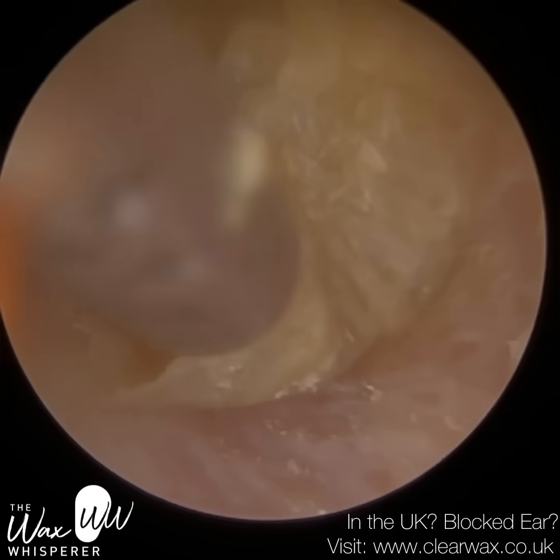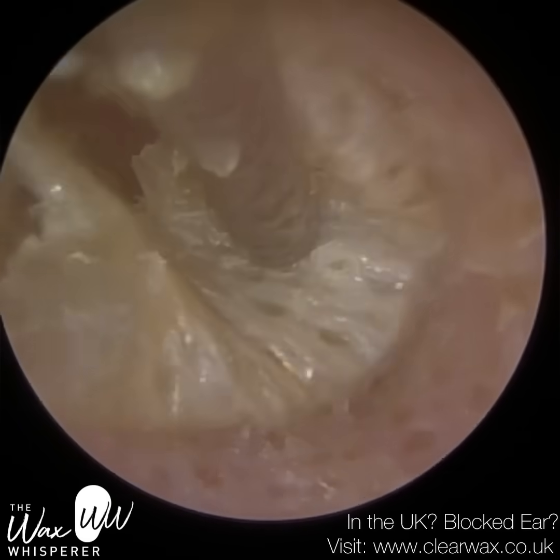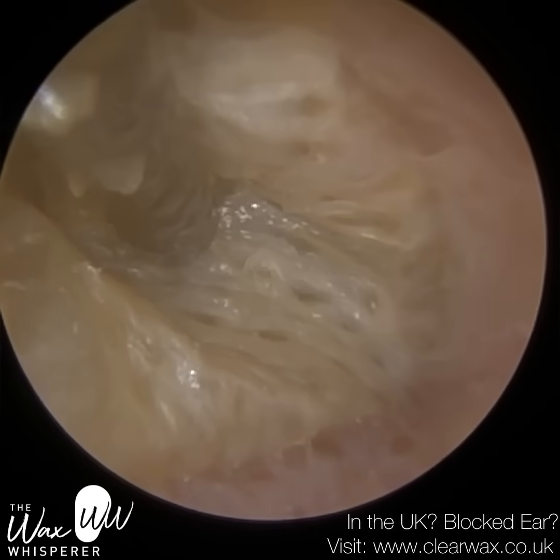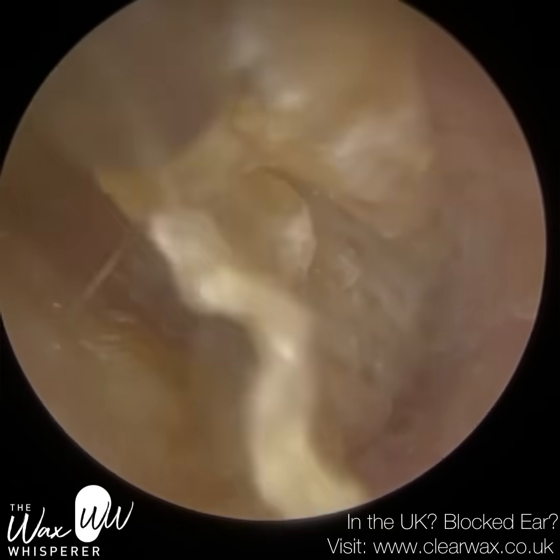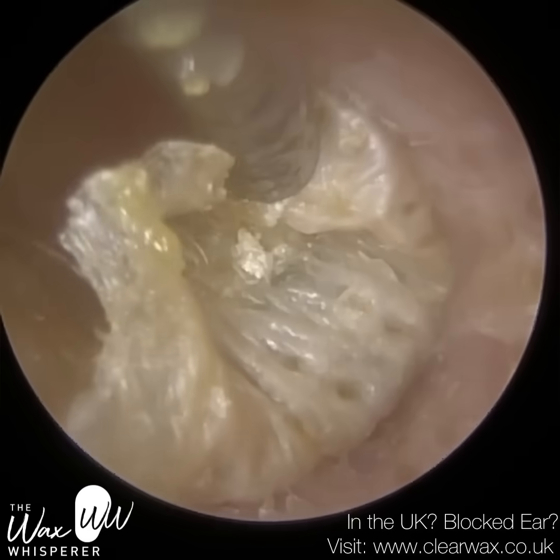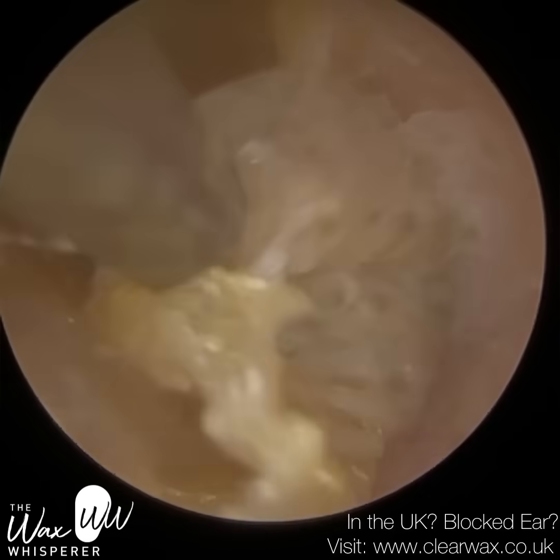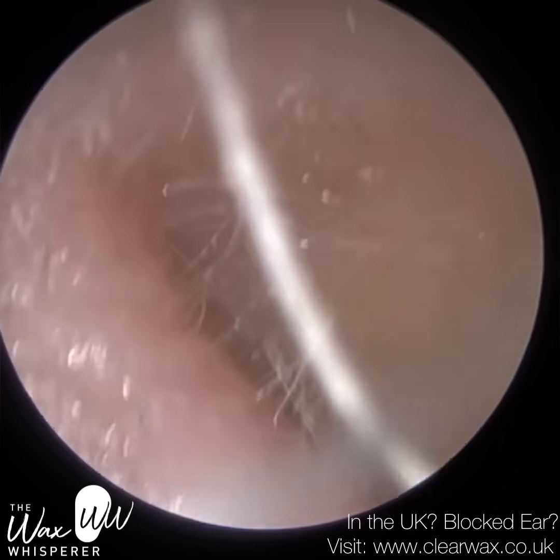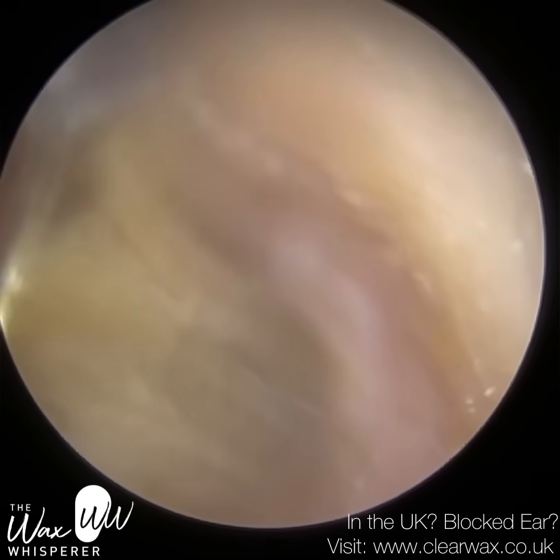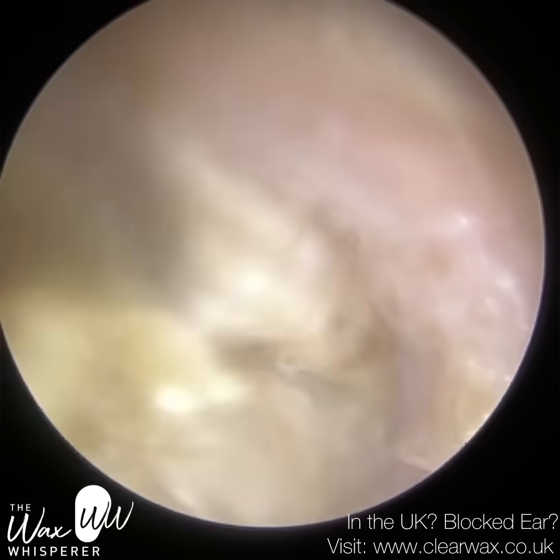Even now watching it — and I think the technical term is goosebumps, but I'll take a bit more research on that — I think it's called a pilomotor erection. It stimulates the sympathetic nervous system and causes the erector muscles, which attach to the hair follicles, to contract, and that's what makes the hair stand up. Even watching this back, it's almost giving me shivers. I've seen blood in the ear before, but this actually had more of an impact, especially at the time of performing the procedure.